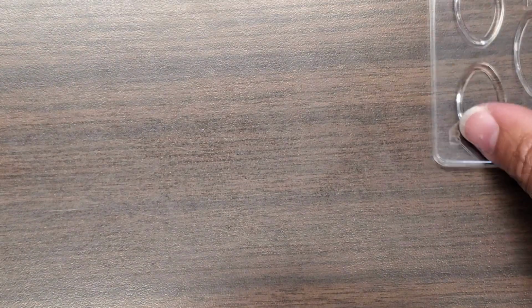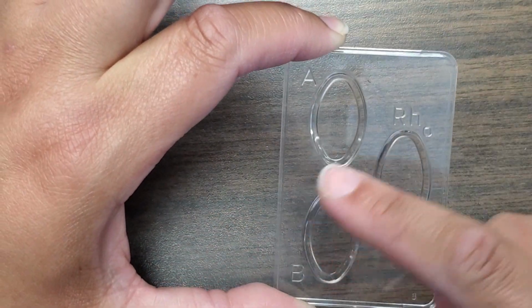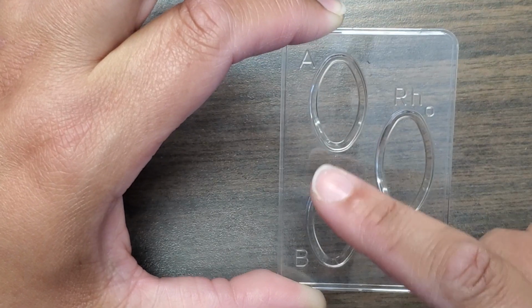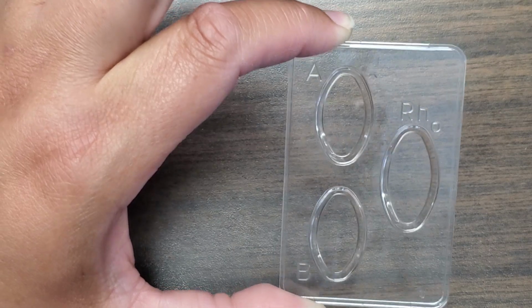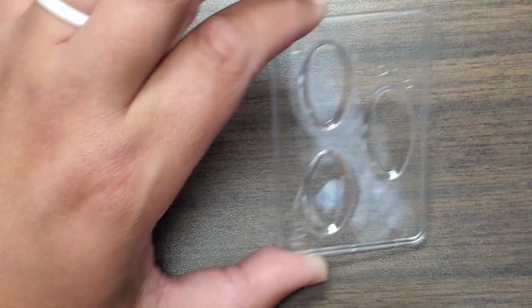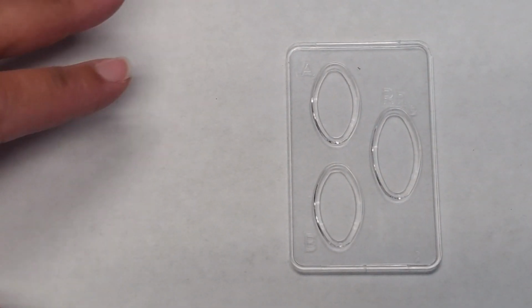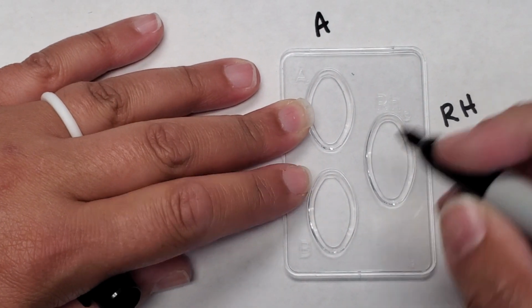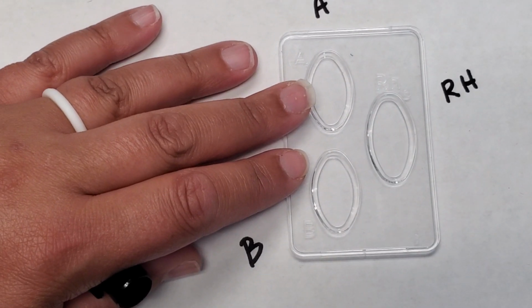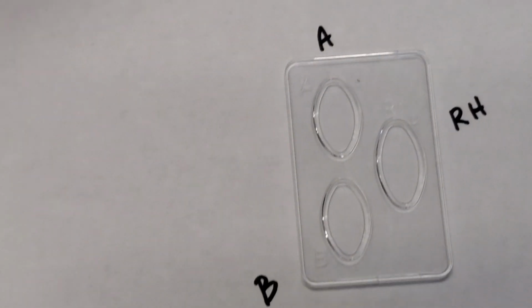In this example, I'm going to show you one well. One of these slides has 3 wells: an A well, a B well, and an Rh well. In order to actually see the blood typing and how it's done, what I want to do is put it on a white background so we can see the 3 wells. Again, I'm just going to mark these on the piece of paper: A, Rh, and B. So what we're doing is testing for the A, the B, and Rh antigens in the blood itself.